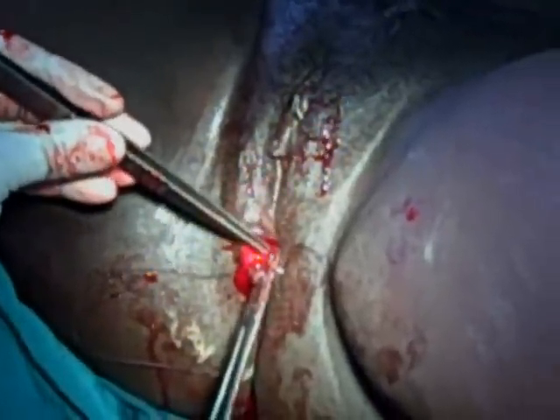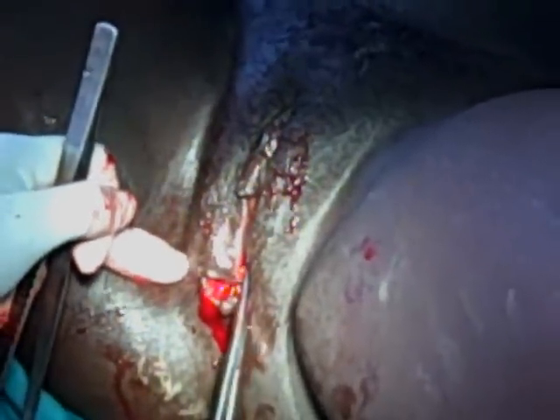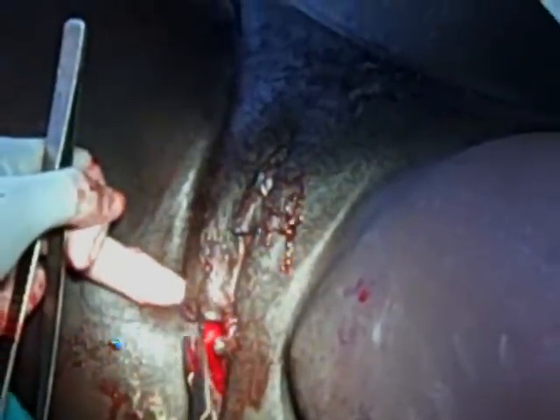The surgeon sutures the perineal muscle, and after completing that suturing, the needle is brought out through the perineal skin. At this point, no knot is tied, as was done at the end of the vaginal suturing.